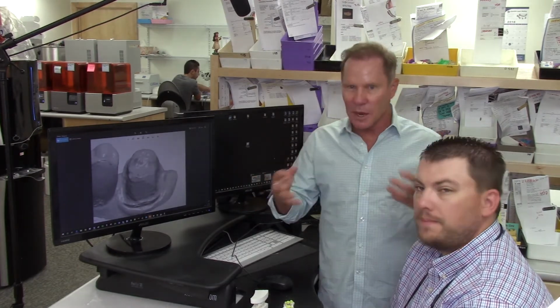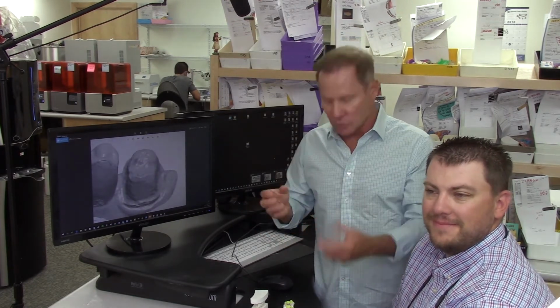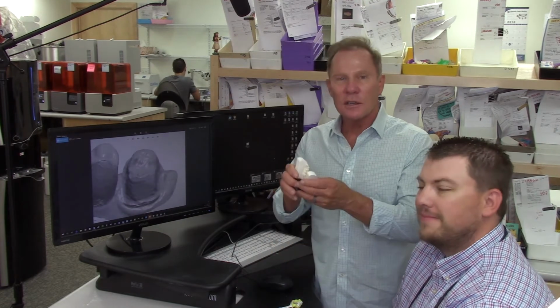So Ed, let's talk a little bit about this, because you know some of my pet peeves, and you deal with it all the time, is marginal accuracy. Yes. Right? And I get that as a clinical doctor. Sometimes it's difficult, or sometimes we get a little lazy and don't pack cord, and I hate to admit that happens, but we see it all the time. And we have great marginal trimmers when we have stone models down in the model room, but they're looking at a 10 to 20 power microscope to try to read your margins.